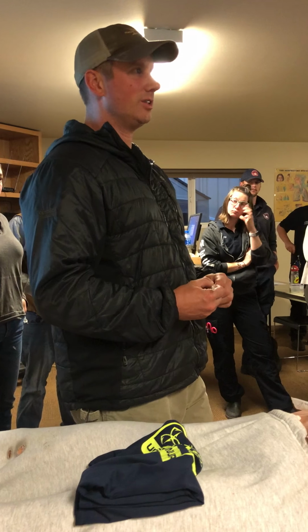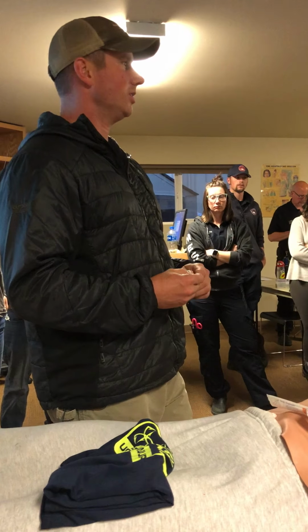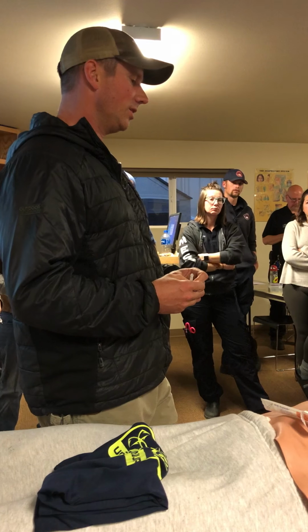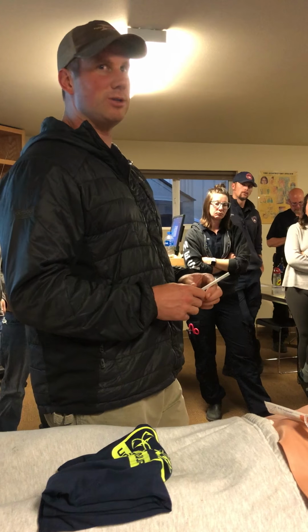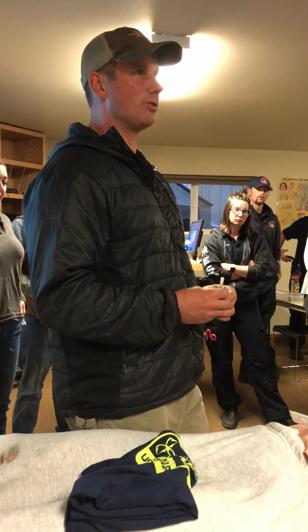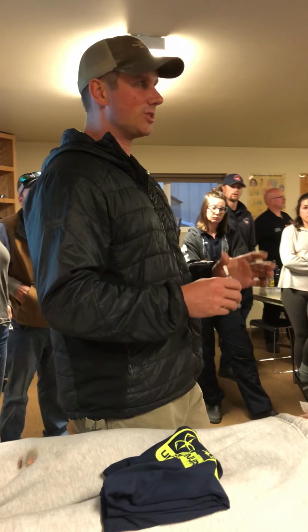We do have some longer catheters, right? The 5 inch. So for really big folks, that would be an alternative too. Of course, with that catheter, you do maybe run the risk of hitting other structures in there. So you have to choose your catheter wisely based on the patient's habitus.